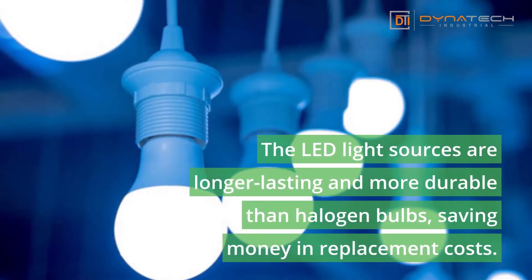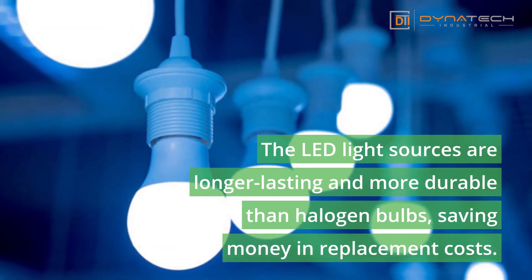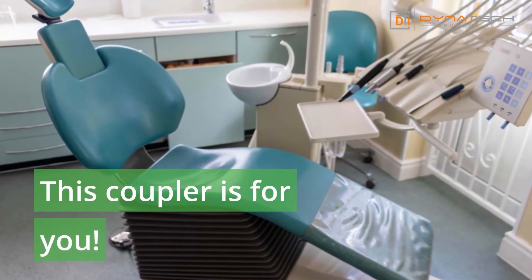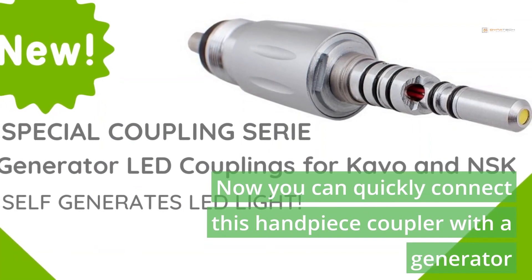The LED light sources are longer lasting and more durable than halogen bulbs, saving money and replacement costs. Still no light in your dental chair? This coupler is for you — now you can quickly connect this handpiece coupler with a generator.